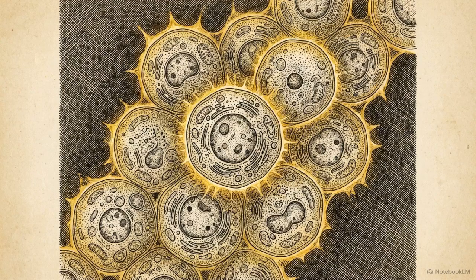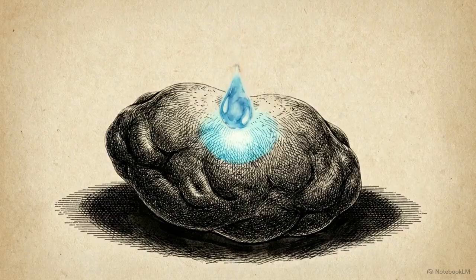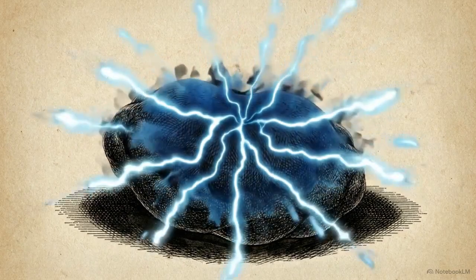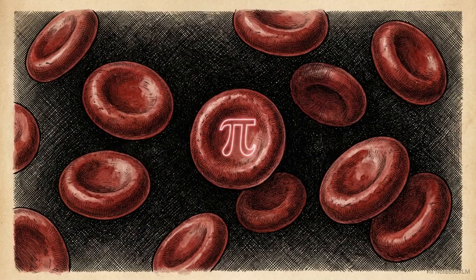You do not wait passively for a result in hepatobiliary imaging. You use chemical agents to coerce the organs into proving their functionality. When attempting to locate an active gastrointestinal hemorrhage, clinicians use a patient's own red blood cells tagged with radioactive technetium-99m.